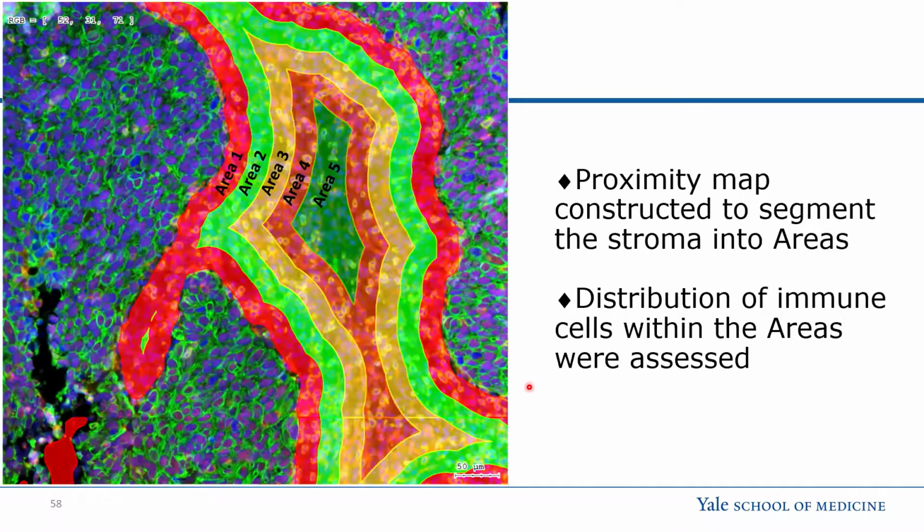The way that we decided to use this is to build a map within the stromal region. And as I mentioned before, the stromal region contains our immune cells. We can break those immune cells into segmented areas, and this is from literally 8 different regions. I'm only showing 5 regions here because of the size of the image. But here you can see that you can very nicely segment these out into regions, into areas, and you can measure multiple things, such as the amount of, in our case, immune cells within these regions, or you can measure the distance from the tumor bed to the different areas of interest, especially if those areas of interest have a unique distribution and makeup of the immune cells of interest.